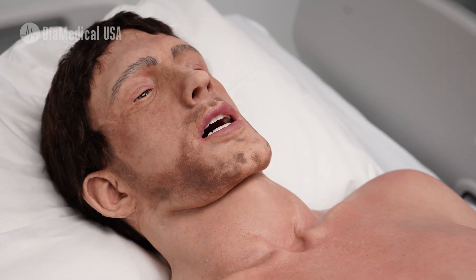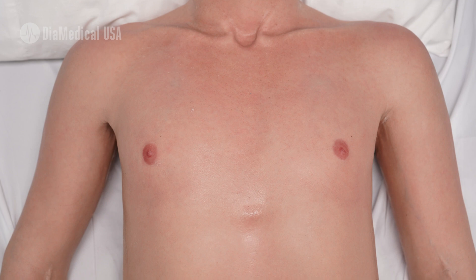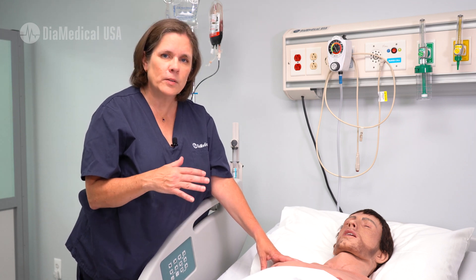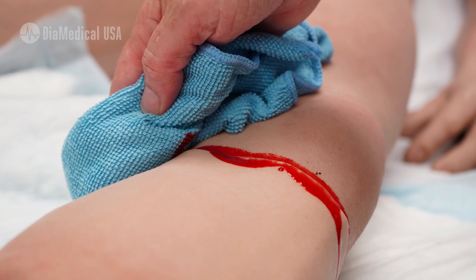He's a full-size adult mannequin. His skin is made from 100% prosthetic-grade silicone, which means he's incredibly washable. You can cover him up with all sorts of simulated blood and bodily fluids, and you can just wash him right off. No staining, no problem.